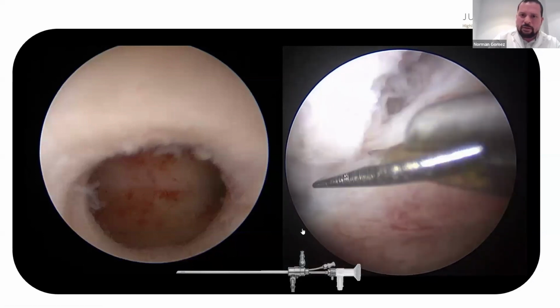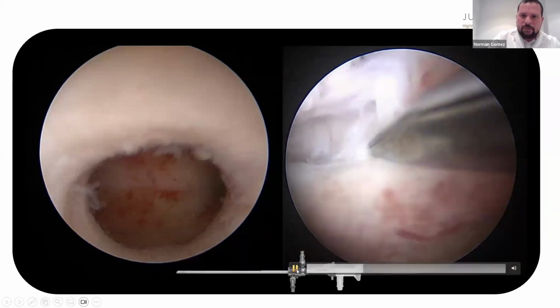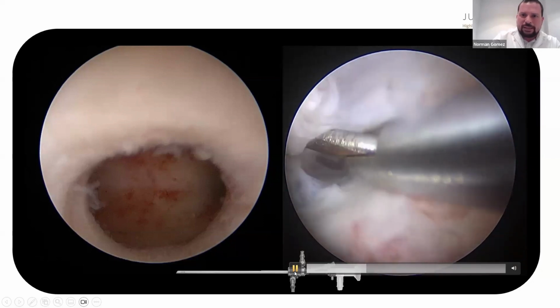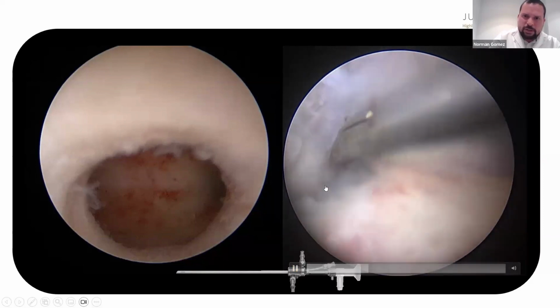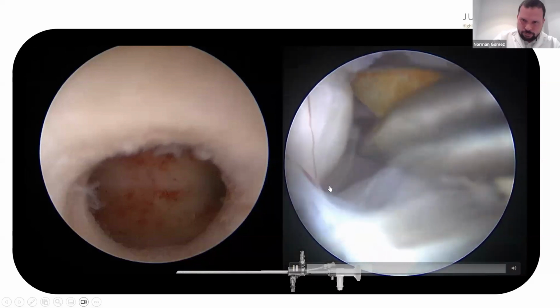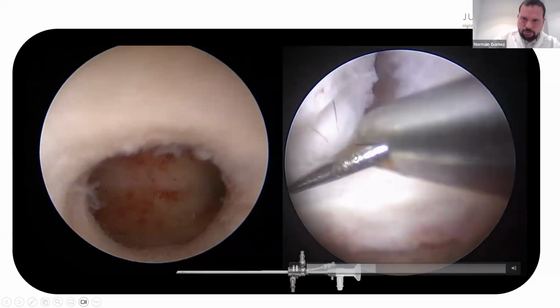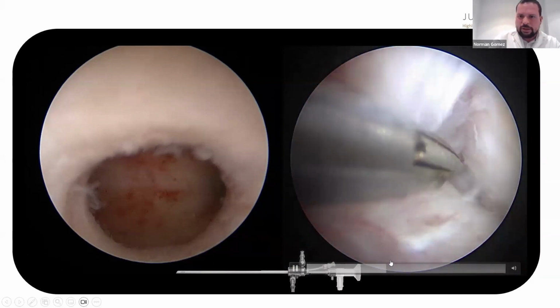So we open the jaw. This is the methodology, I think. You open the jaw inside the pseudocapsular plane, and doing like this, you visualize the transverse fibers. When you visualize the fibers, you change the direction of the scissors and cut them, and repeat this operation several times. Then repeat the same operation on the other side.